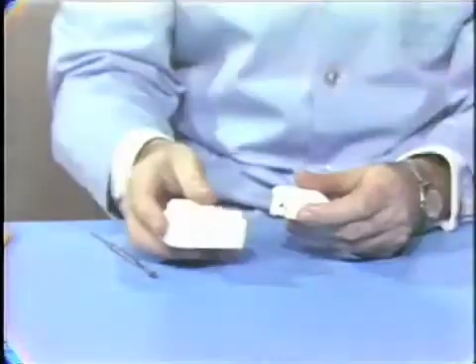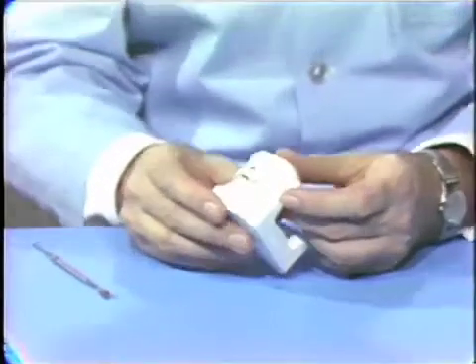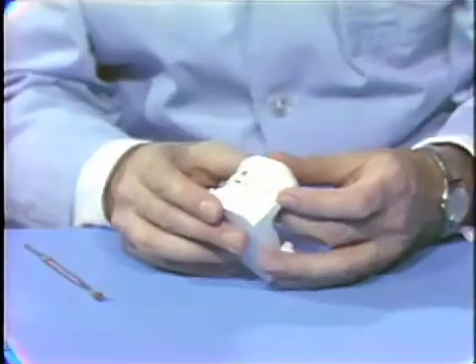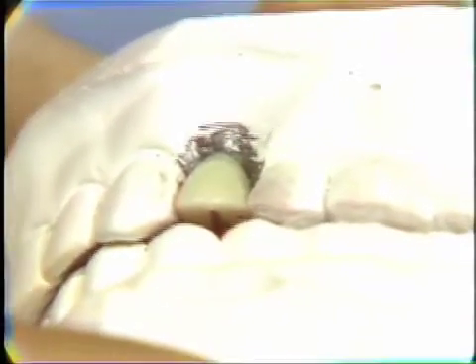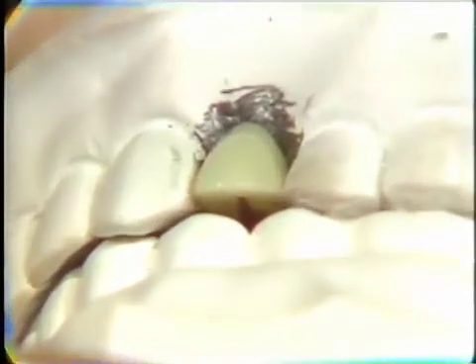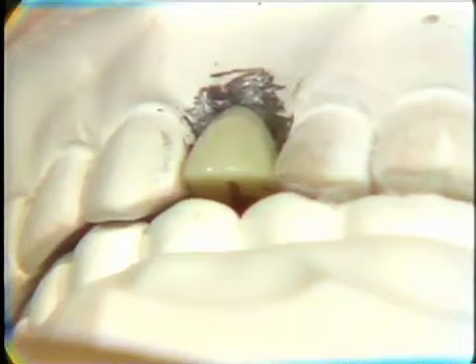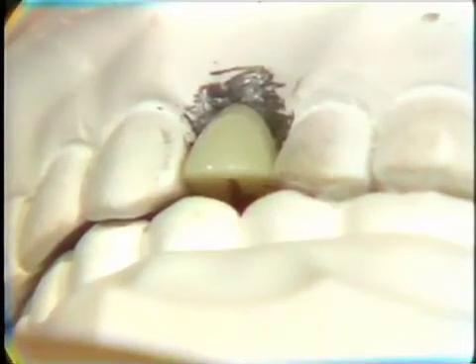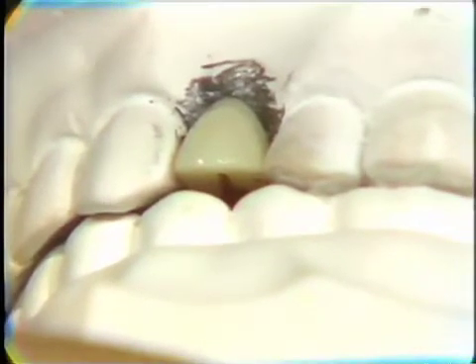One of the things to do at this point is to apply the opposing model and to examine the relationship occlusally between these two, and I think on a close-up here you can see the sort of thing that you've got to look at. You must have enough space there between the tips of the cusps of the mandibular teeth and the pontic facing there to allow room for the gold backing and the occlusal surface that has to be developed.